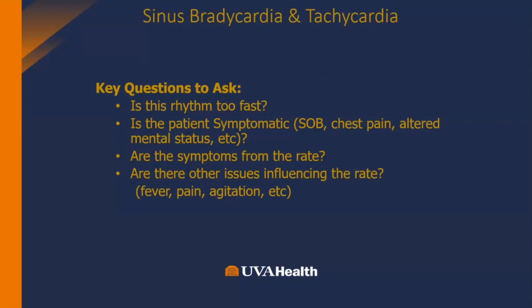Once we see a sinus rhythm or a rhythm that has a sinus base or origin, we really need to think of why is this happening? What are the physiologic causes of this rhythm? And we should not treat the tachycardia. In other words, if I'm in sinus tach at 140 because I just ran up the stairs, I probably should not get a dose of adenosine. That's my heart compensating. So keep that in mind.